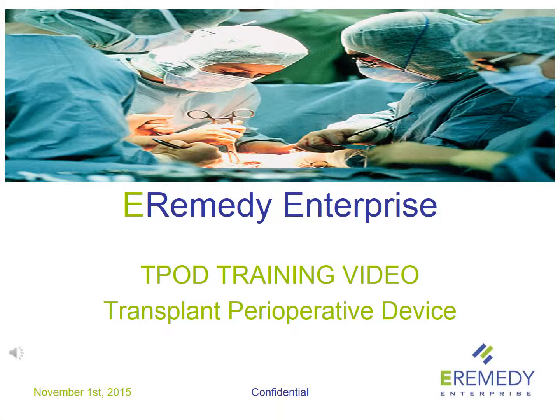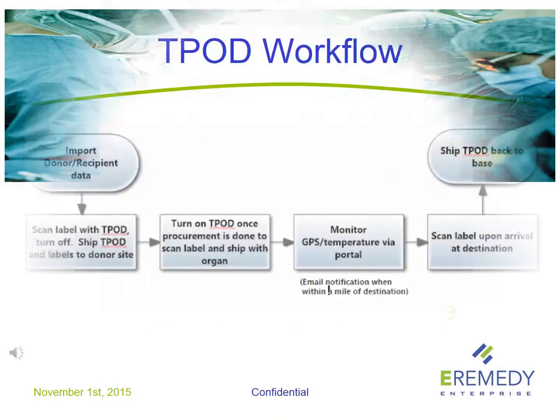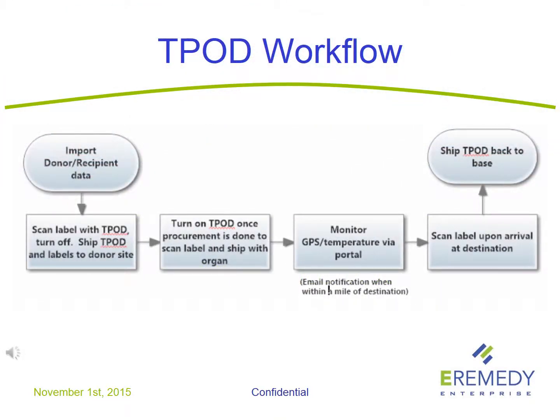Transplant Perioperative Device, also known as TPOD, was designed to simplify, track, and verify the transplant process. In 11 short minutes, we will provide training on how to use your TPOD. The general steps are highlighted.